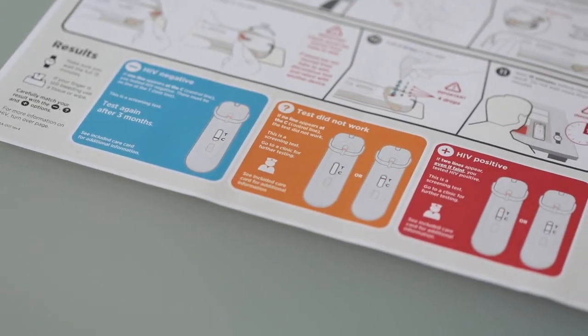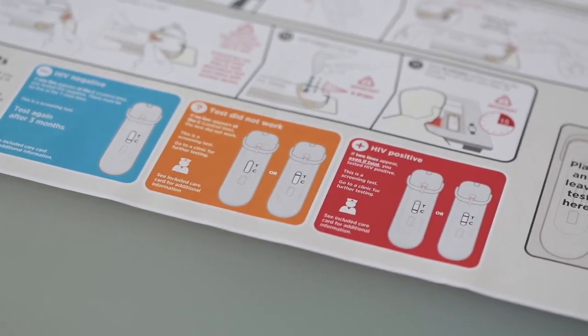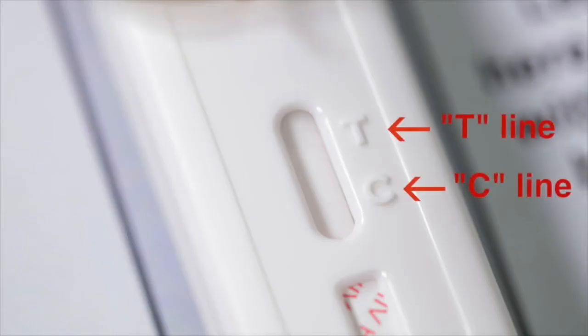Now match the lines in the results area of the test with the colored boxes on the instructions. It is the lines next to the C and the T which tell you your results.